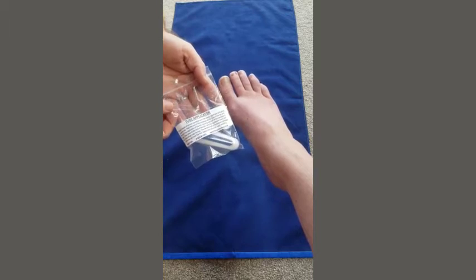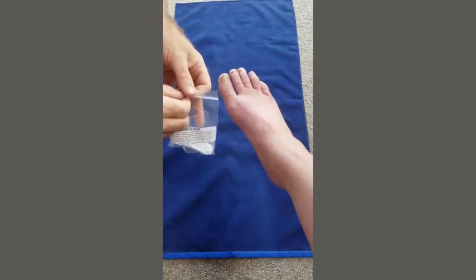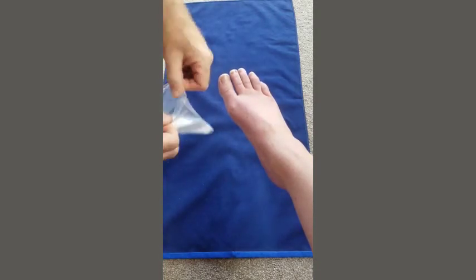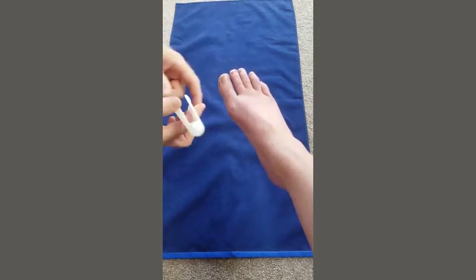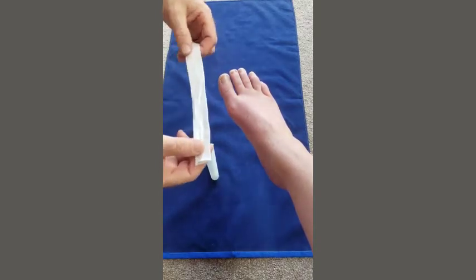Welcome to First Aid for Feet instructional video on our tube applicator. This is used to help apply tubular bandage to toes. You open up the packet and take out the applicator — it's a plastic applicator like this — and you take a length of tubular bandage.